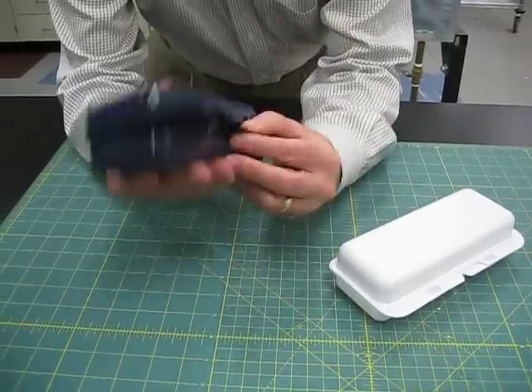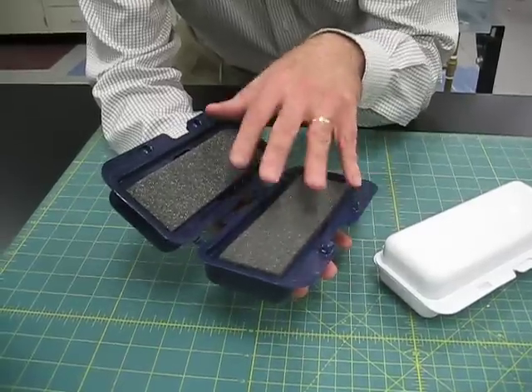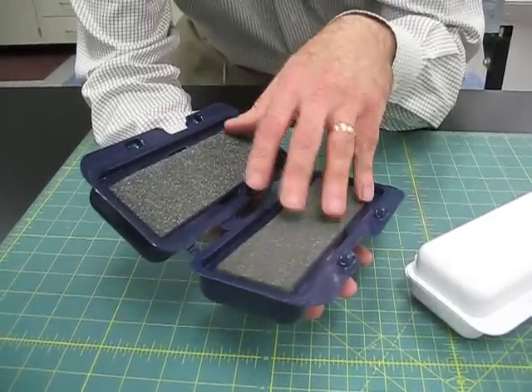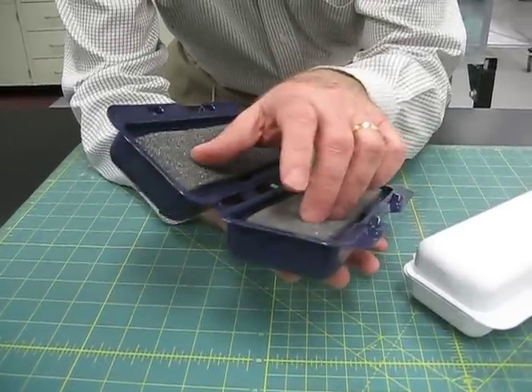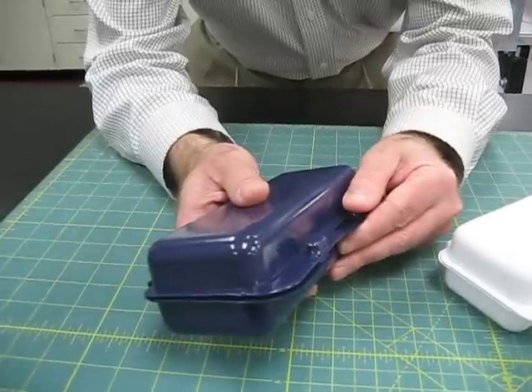This gives you an idea about the approximate size of it. It has these clips so that it stays closed, and it's designed on the inside to have foam so there's not a particular style it needs to go in. The product is simply cushioned inside and closed up.